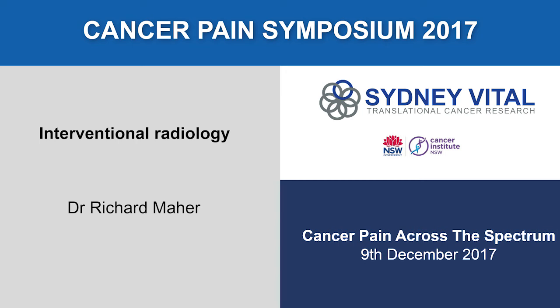And then if we just look at, hopefully this will run here, this is just a video showing an injection. You can see the dark stuff, the cement coming in through the needle, and you'll see it. And you have a certain mixture of cement. You don't want it too viscous, you don't want it too runny. You want to see it coming out in a controlled fashion. You want to see where it's going. Because as we'll talk about, some of the complications involve where it spills if it goes in the wrong place.